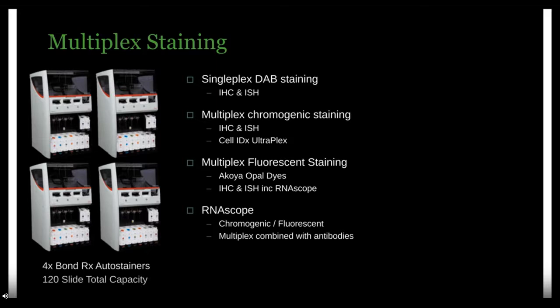They provide simplex chromogenic stains, right the way through multiplex chromogenic and fluorescent stains, not just antibody stains, but ISH multiplexes as well, IHC-ISH combination assays, and they also provide the staining for our digital spatial profiling assay that I'll detail later.